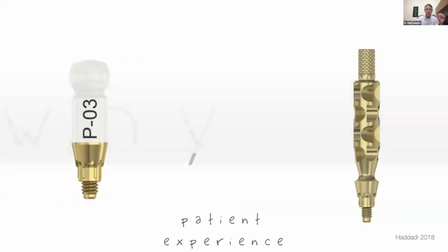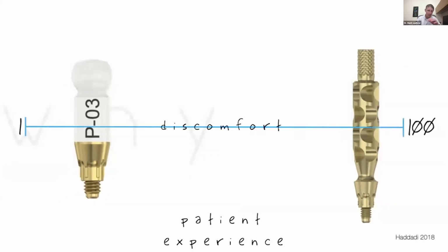Now, the interesting thing, when we go back to that patient experience, this lovely paper by Haddadi was a split mouth design where they took conventional impressions on one side and scans on the other side, and they were looking at discomfort and at the time it took to do these things. From the discomfort level, 1 being completely comfortable, 100 being very uncomfortable, the intraoral scan clocked in as a 6. Very, very comfortable, easy to use. When you looked at conventional, it dropped to a 73. Pretty uncomfortable. And I hope you see the story over and over again: patients generally prefer the scanner.